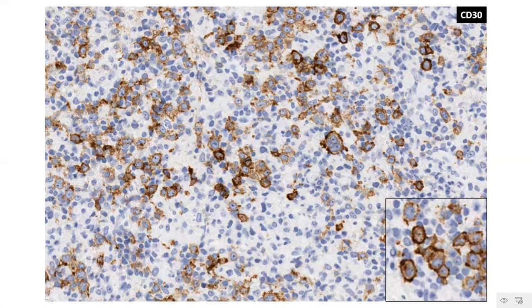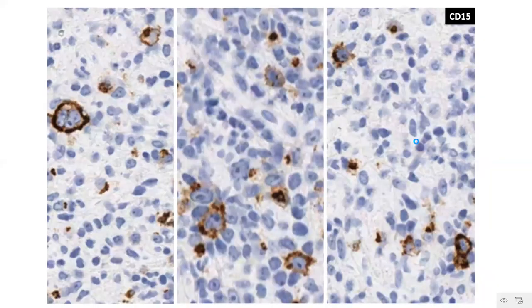Now, CD30 shows a strong positivity in the membrane as well as in the Golgi zone. So now that's one point towards the classic Hodgkin lymphoma. But then you also have to keep in mind the possibility that even primary mediastinal B-cell lymphoma may express CD30. However, the expression is usually not as strong in the case of primary mediastinal B-cell lymphoma.